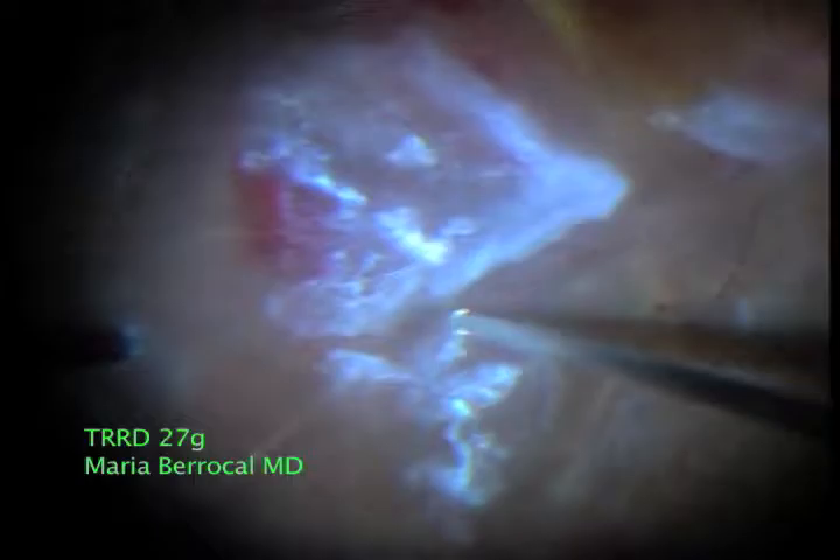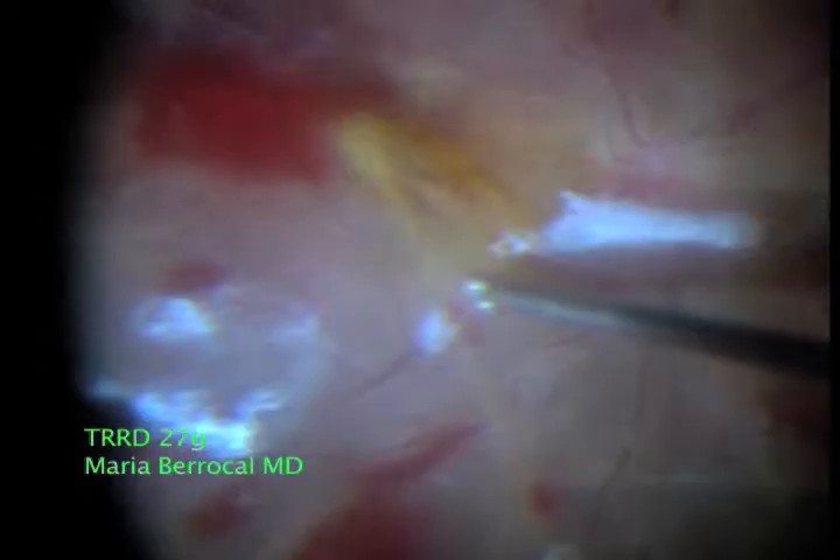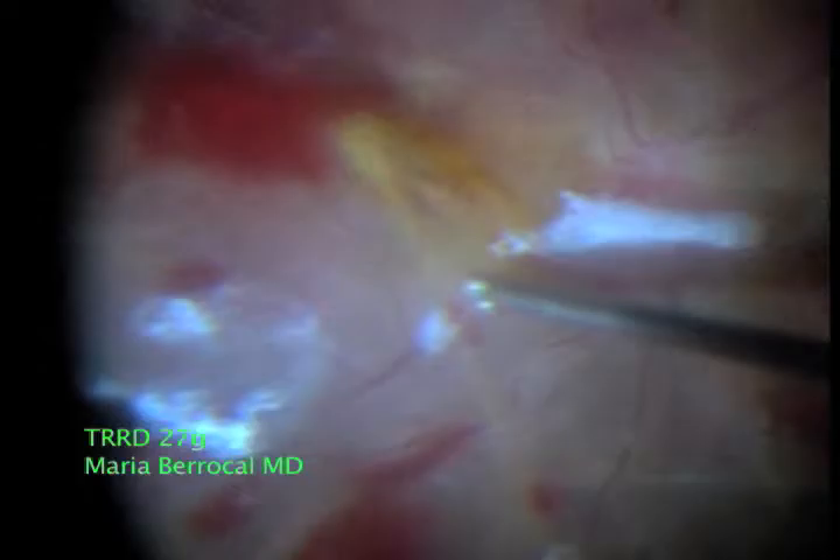Segmentation is performed with blunt dissection, as can be observed here, and the tissue is very safely shaved from the surface. This is done in part thanks to the cutting rate of 7500 cuts per minute.